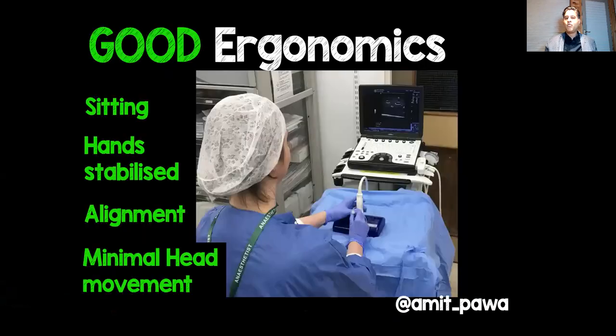So Dr. Barron then thought about what she was doing. She thought, aha, now if I sit, I can now align myself, so I'm looking at the machine, and I can look where my hand is, I've got my hand stabilized, got minimal head and neck movement, that's great ergonomics. So think about your ergonomics whenever you're siting a block, because I guarantee your blocks will be more successful if you think about ergonomics.